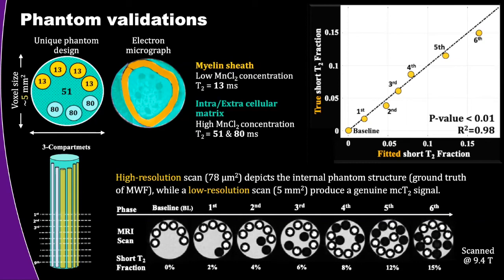And then if you don't mind, just one more quick question. One thing that I've always wondered about, especially when it comes to the myelin water, is that people ascribe the myelin water as being myelin water. But in many tissues, the mitochondrial density, the volume of the intracellular volume, can be up to 25%. And one would expect the mitochondria would have very short T2. So I'm wondering, have you ever picked up other components that look like they might be the mitochondria or other things?